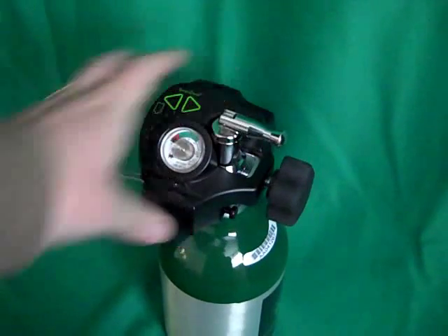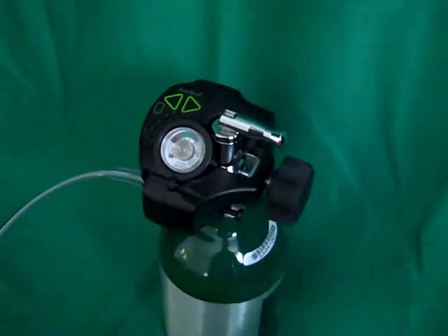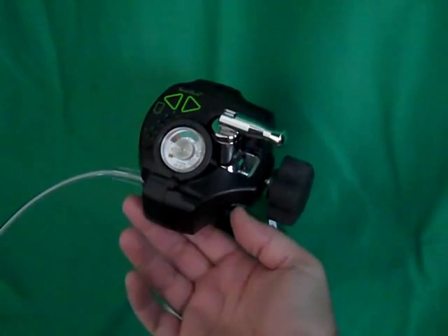SmartDose is equipped with a continuous flow backup. To switch the unit to two liters a minute continuous flow oxygen, simply pull out the black knob opposite the barbed fitting. Push it back in to switch the unit back into the SmartDose pulsing mode.